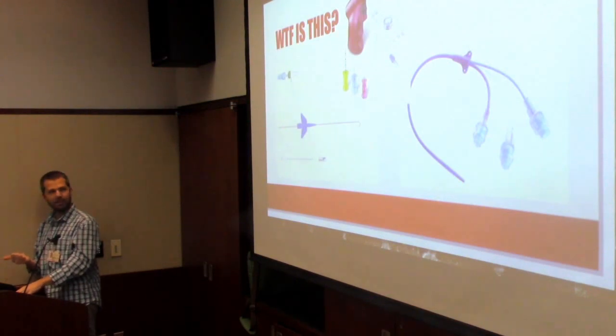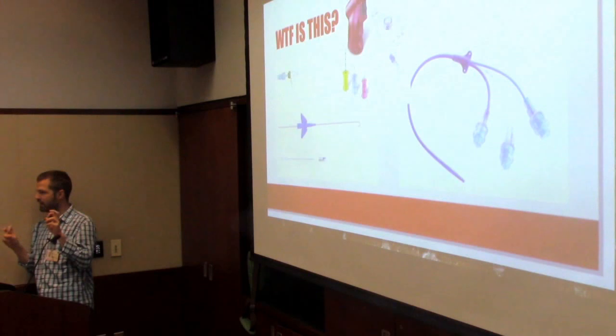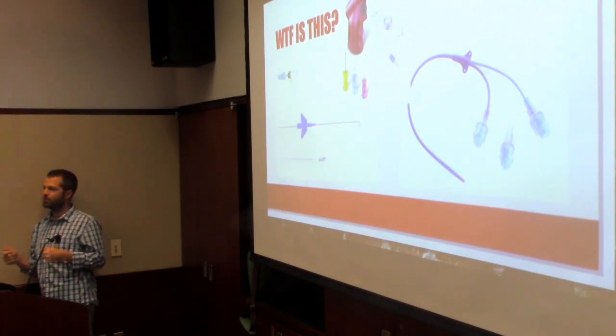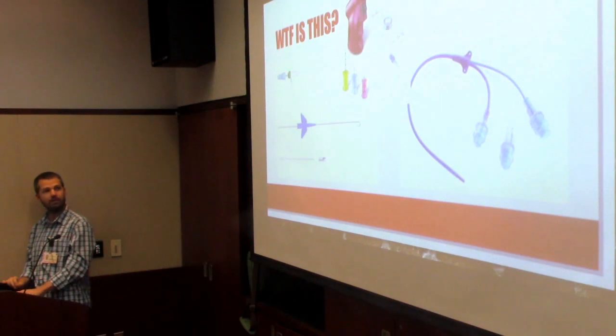All the triple lumen catheters, I think we counted 7 different brands. They're all relatively the same. The length of them and the pressure rating are the 2 biggest things I found to be important. And for anybody who is ever going to get an imaging study, I make sure that it has a pressure rating, or it's a power PICC or a power central line, because that's the worst thing in the world, where you put a central line into somebody, but you can't use it for any imaging modality. And apparently they only cost an extra $1 or $2, so there's no reason to not just stick slightly thicker plastic tubing into somebody. And that was the big thing I learned as an intern.